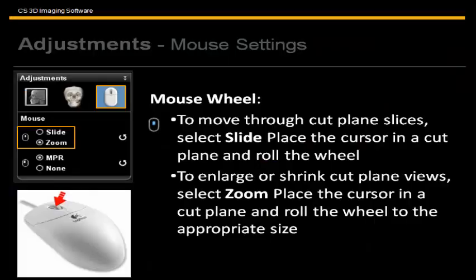Please note, you can click on Mouse Settings in the upper left under Adjustments to change the active setting for your mouse wheel. Choose Slide to use your mouse wheel to scroll slice by slice through any cut plane, and choose Zoom to use your mouse wheel to zoom in or out when scrolling.